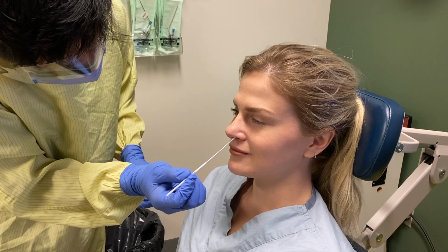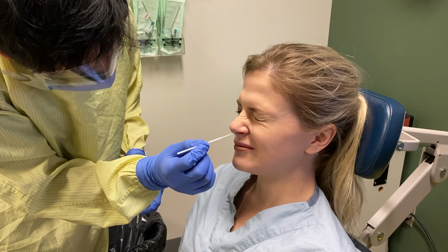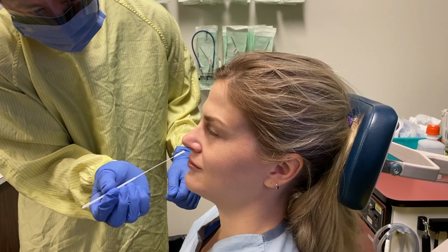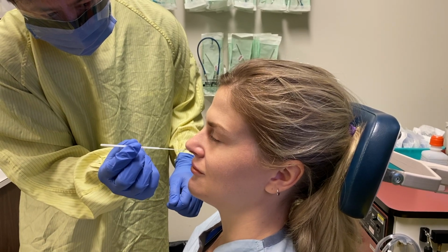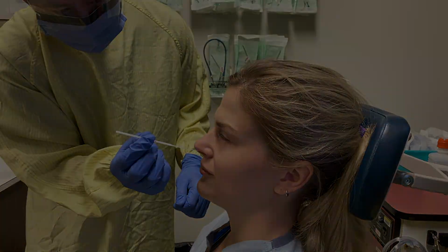You may instruct the patient to breathe through their mouth during this procedure. If the patient feels they need to sneeze, tell them that they should raise their hand. To re-illustrate, the swab enters the nose at the same angle as the dorsum or bridge of the nose. It is then slowly rotated so that it is horizontal in position, parallel to the hard palate.